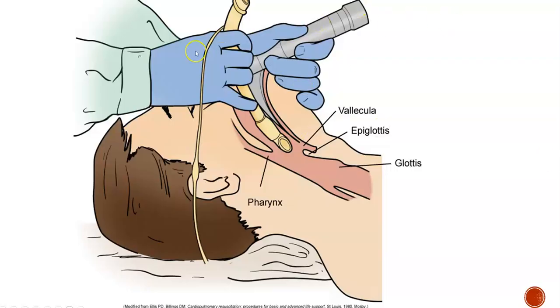And then we will see a variety of these used, different shapes, different sizes. The provider or respiratory is going to know what size the patient needs. When we intubate somebody, we want them supine with their neck flexed and their head slightly extended, kind of like in the sniffing position. And this just helps open up so that they can get that tube down in the right spot.